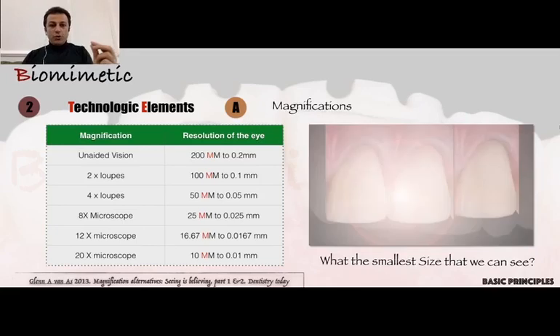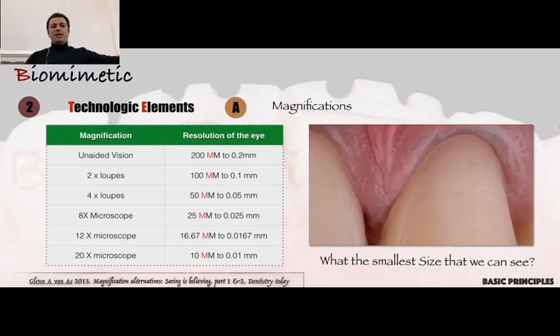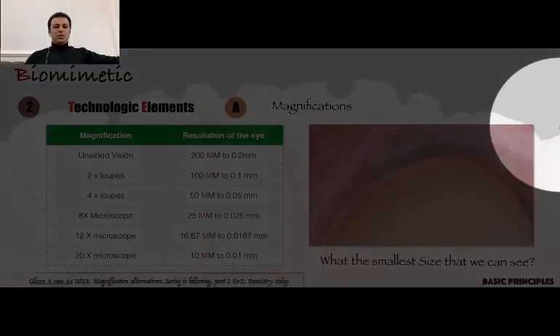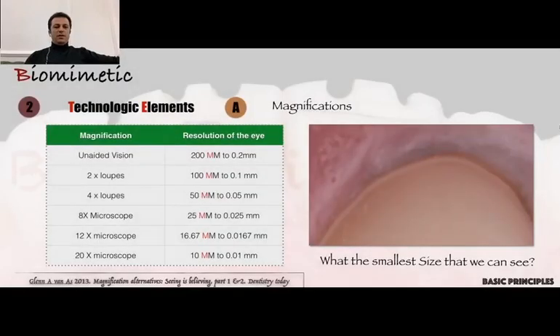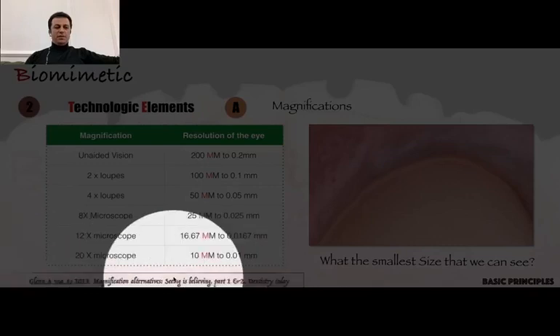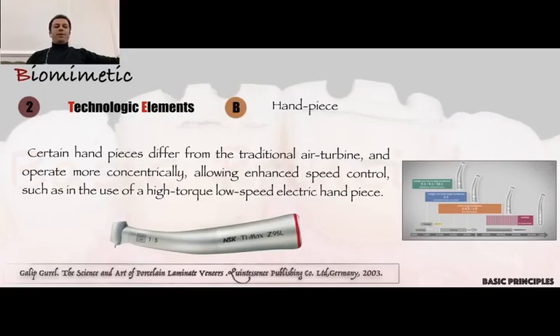So what we should do is use magnification, and you can screenshot this slide, or go to the article here, which explains the use of this magnification alternative, seeing is believing. Okay, so that was the first one, magnification.